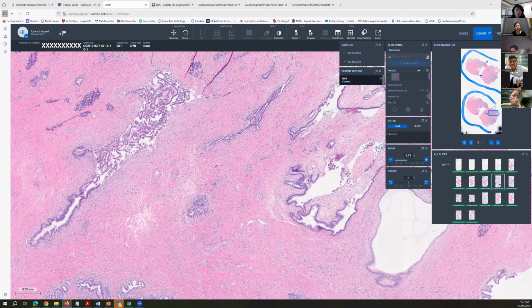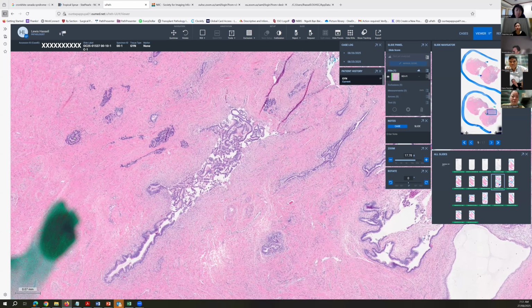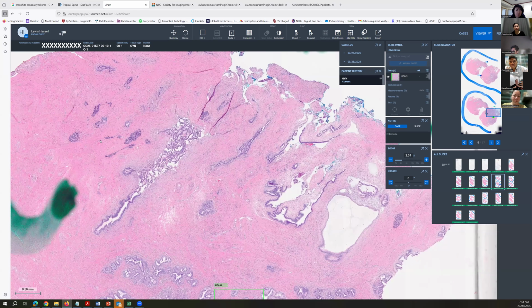But a lot of these areas, like here, there's just no reaction to this tumor, even though it's clearly very hyperchromatic and so forth. So those were some interesting findings from this particular case. I'd defer to any comments from Dana or from Mini or Esther about your thoughts on this case and how you approach this problem.